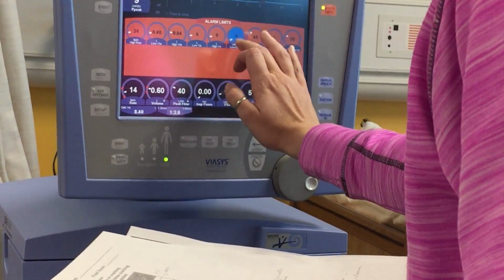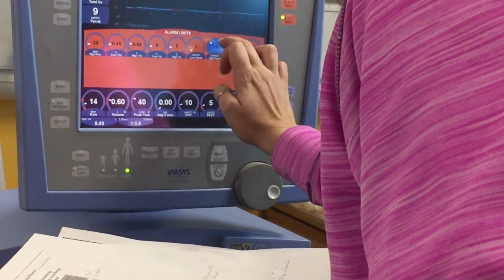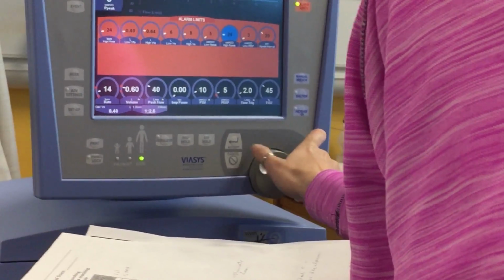Okay. And what am I going to set my high at now? So 10 above. You get this right. And it'd be 19, right?